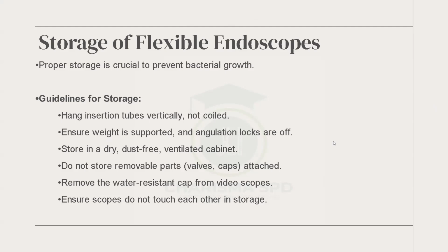Storage. Hang it vertically so that the excess chemical and water will drain off. Okay, ensure weight is supported and regulated, and angulation locks are off. Store in a dry, dust-free, ventilated cabinet.